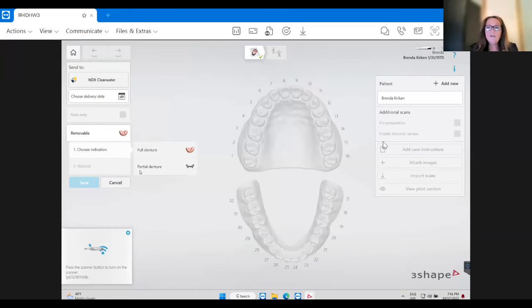So let's say even if the patient broke it in half, glue it together, and then I like to do either a rigid border to border mold, depending on how old their dentures are. If it's fairly nice fitting still and has a little bit of suction, I would just do a little heavy and light wash in it. And I usually like the blue and green material. It shows up much better. It's easier to scan that.